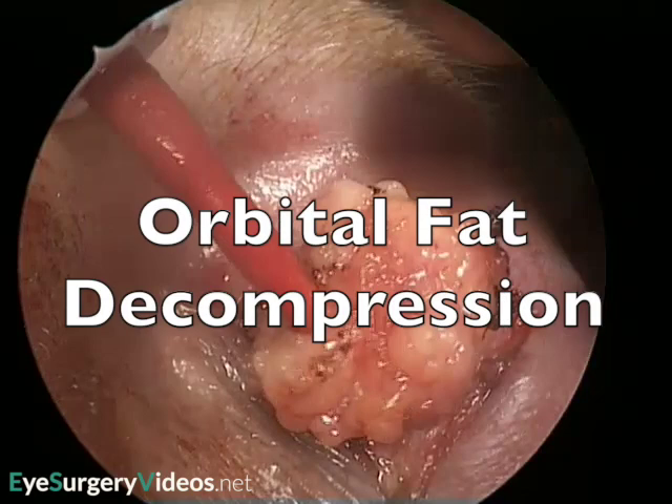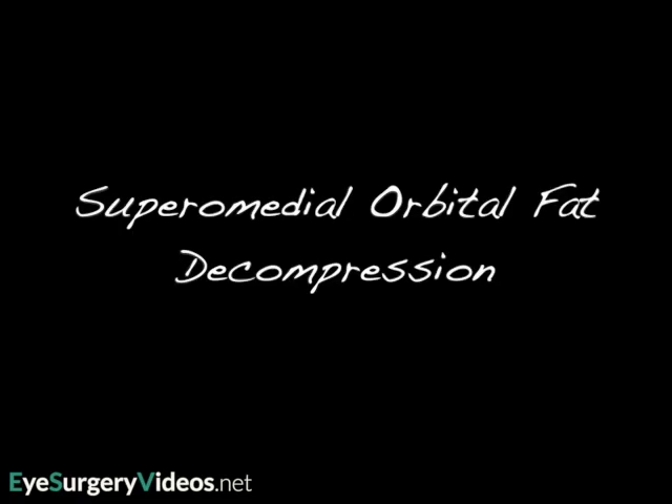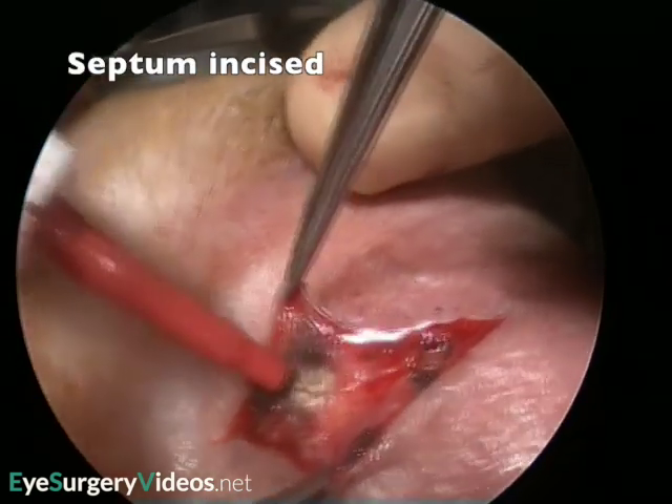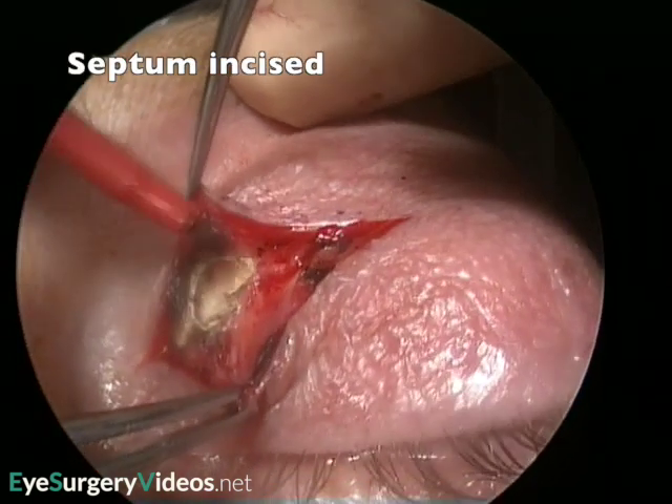The medial half of the upper lid skin crease incision was marked pre-operatively and infiltrated with local anaesthetic with adrenaline. The skin and orbicularis have been incised, and the septum is incised.